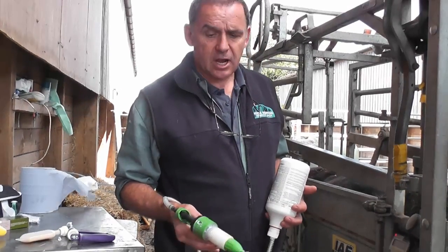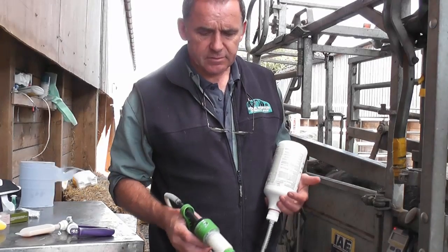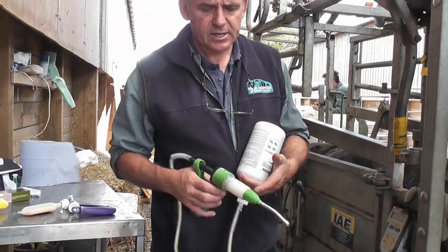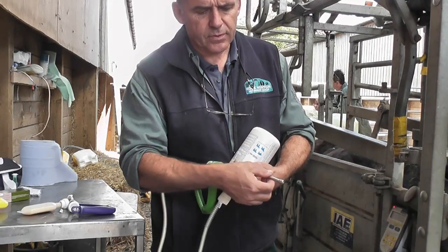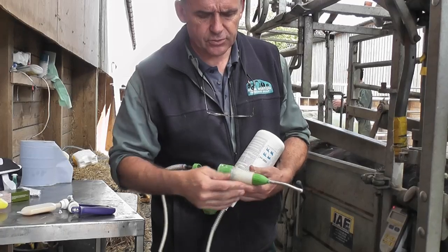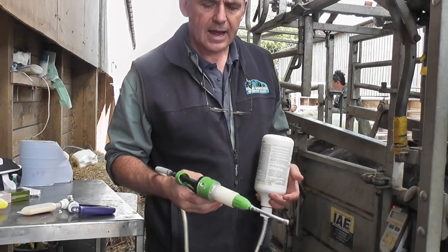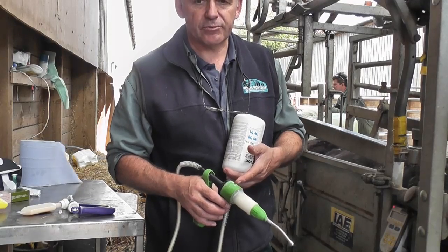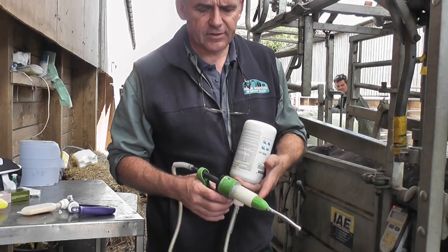We're going to drench these calves. When you're drenching calves, it's important to make sure that the burette is calibrated, that you've got a nice smooth mouthpiece with no rough edges to cause any damage to the calf, and that you check the calibration. You can do that simply with a syringe to check that it is delivering the correct dose.